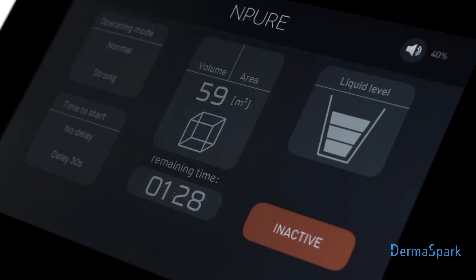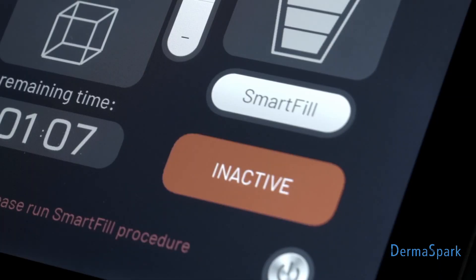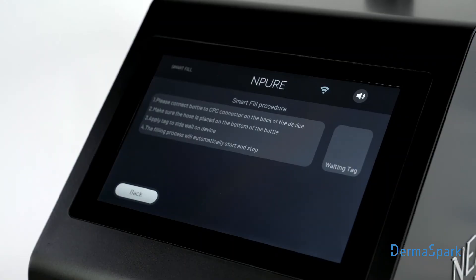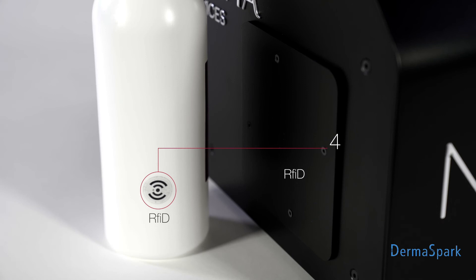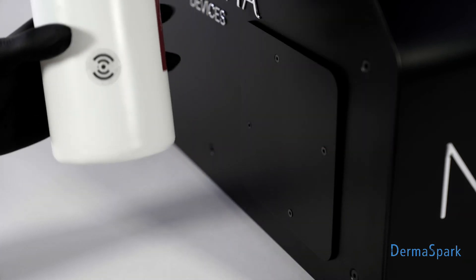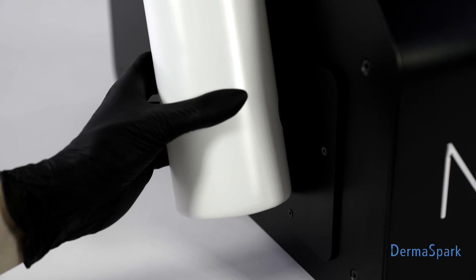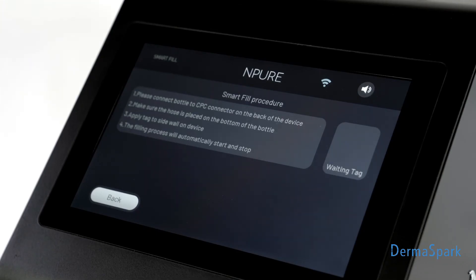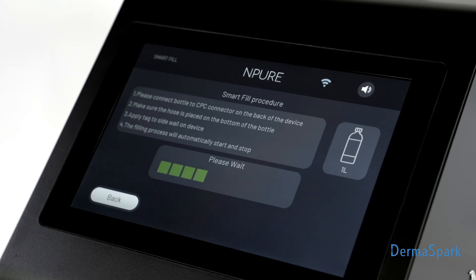Step 6: Turn on the device and enter the Smart Fill mode. Unlock the device with the RFID tag. The device will fill automatically. The device will show you a message when the procedure is completed.